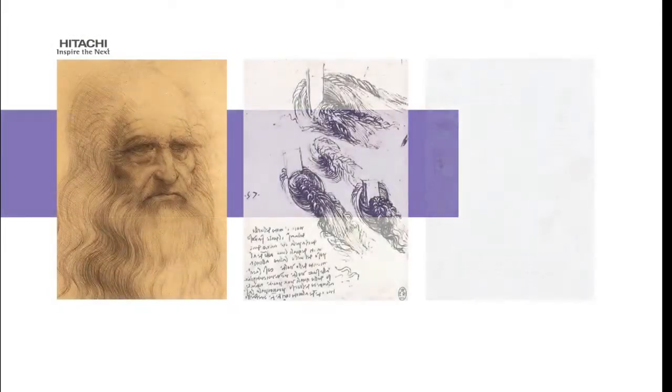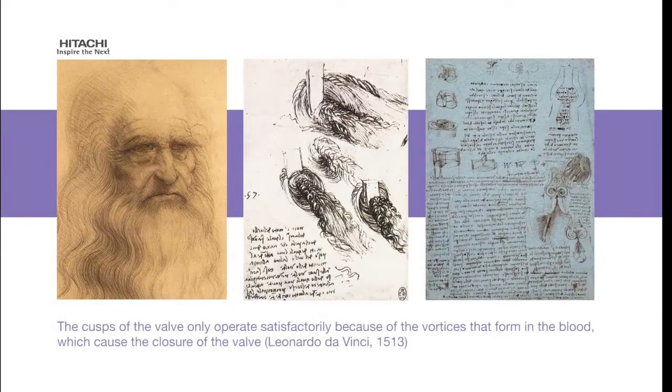In 1513, Leonardo da Vinci noted the importance and relationship of vortices within the cardiac blood flow. Today, we are able to use our VFM technology to easily evaluate these vortices.